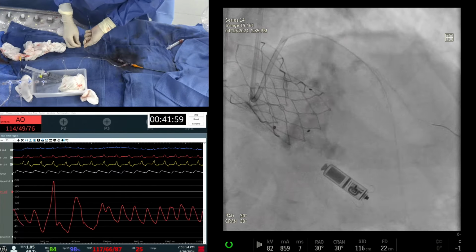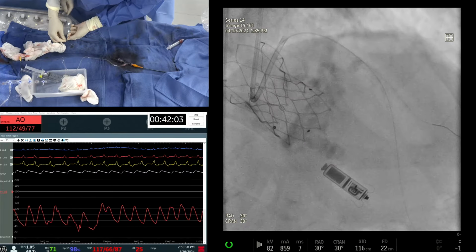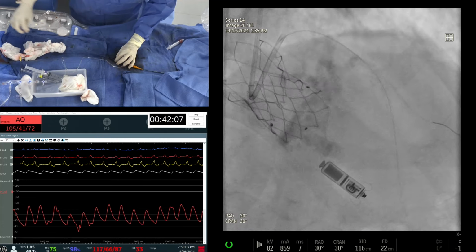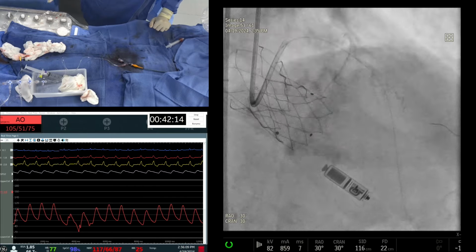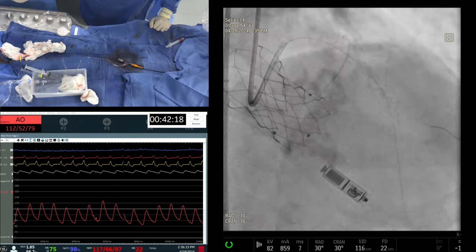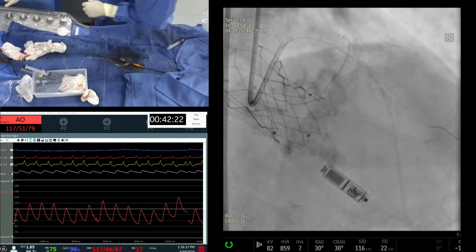But before we do that, if we go to 2-stent strategy, we can go now with 2-stent strategy. Otherwise, I think we need to balloon it and have a good result and then stent the main vessel. Now, the main vessel, we did not dilate, right? No, we are going to dilate now. 3.5? 3.0 for there, 3.5 proximally.